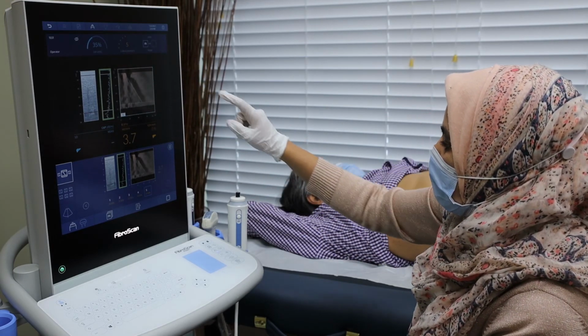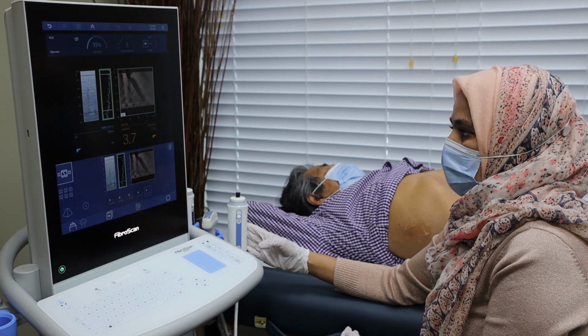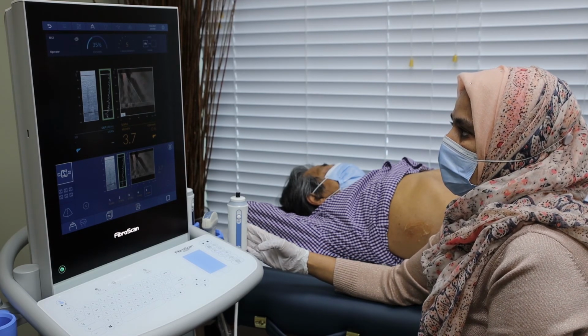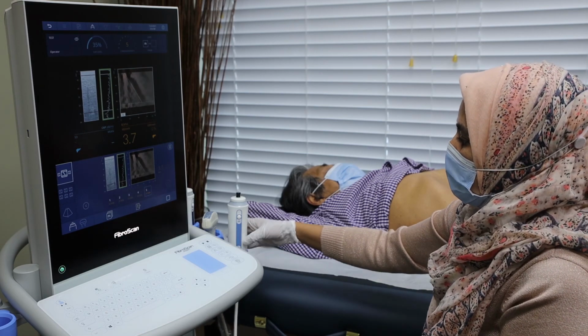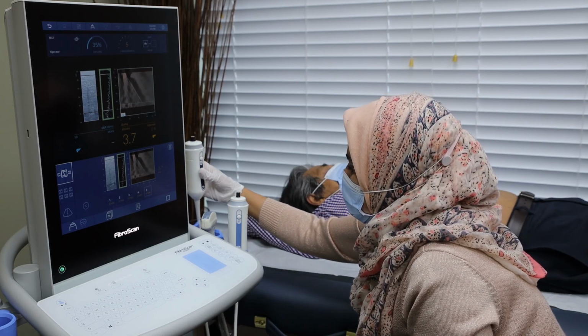The new M and XL probes can now measure much deeper tissue. The two depth measurements of the XL probe will be automatically adjusted based on the distance between the probe and the liver capsule.